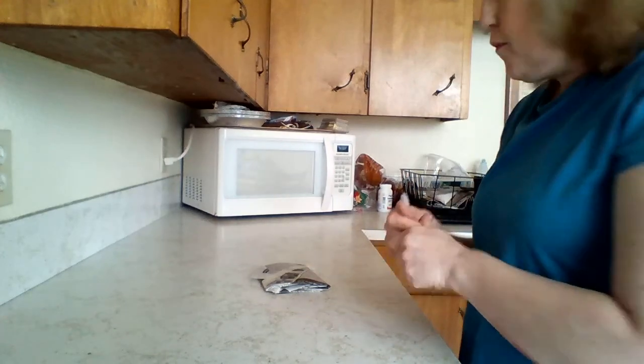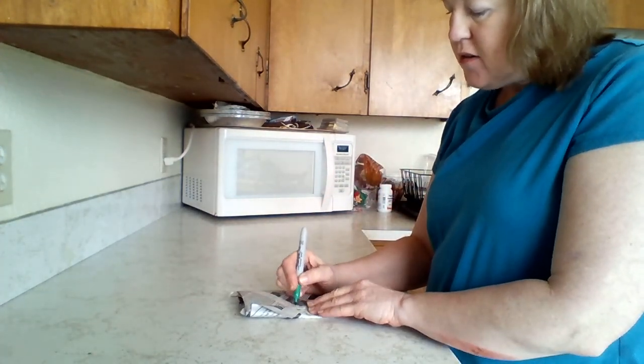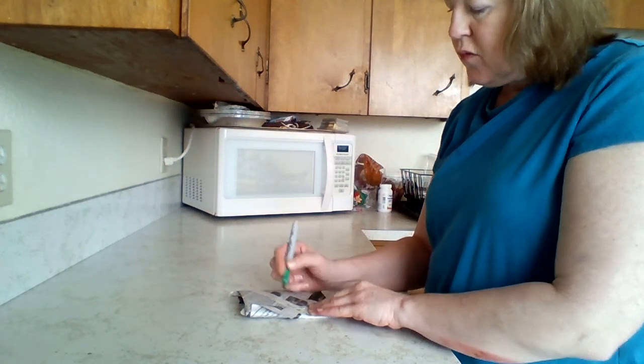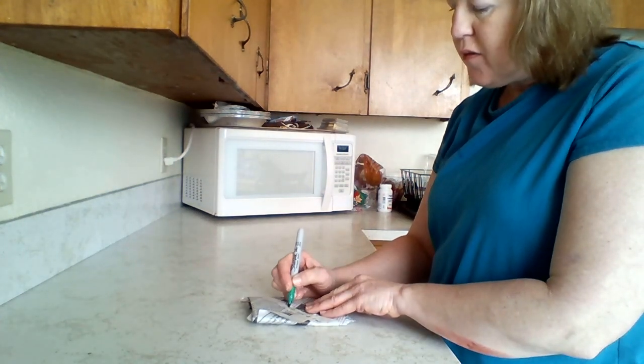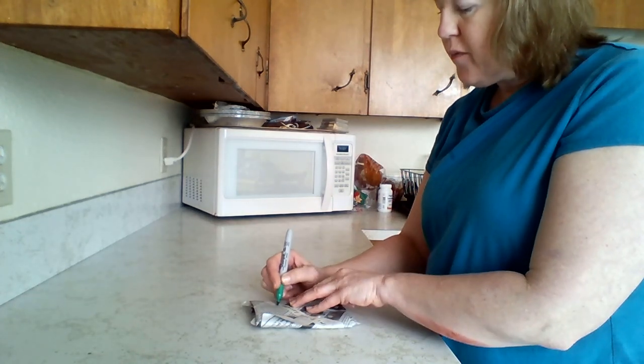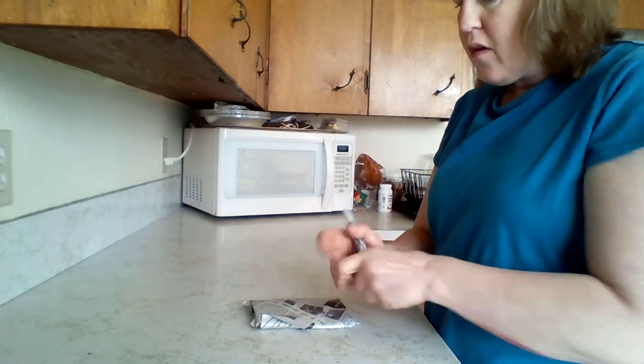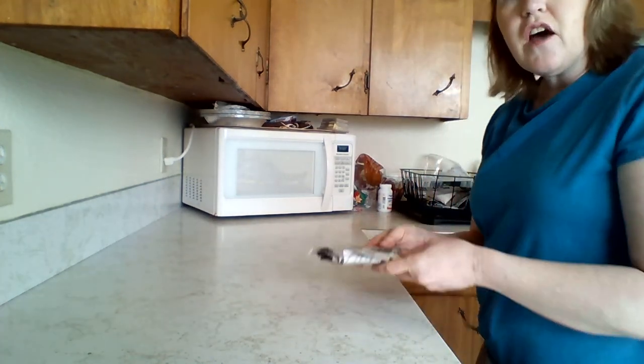I'm going to label my initials, the date, and what type of kit it is. It's a laceration repair kit. And now it's ready to go into the autoclave.